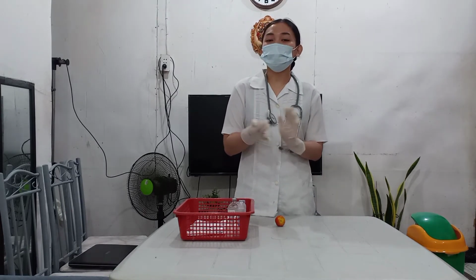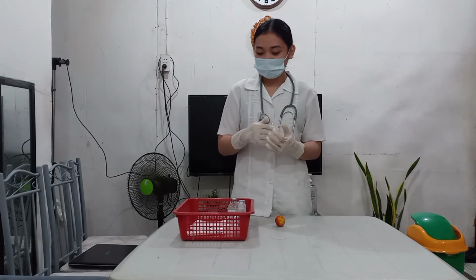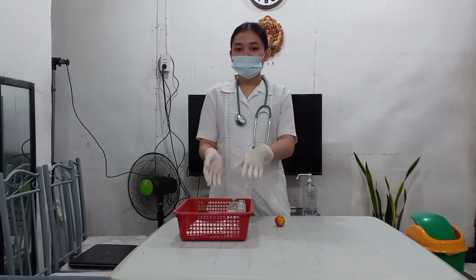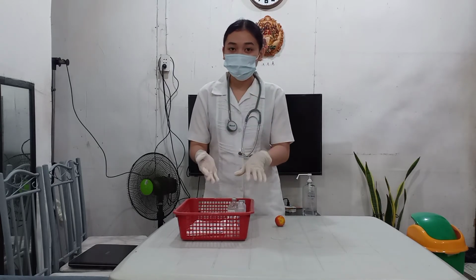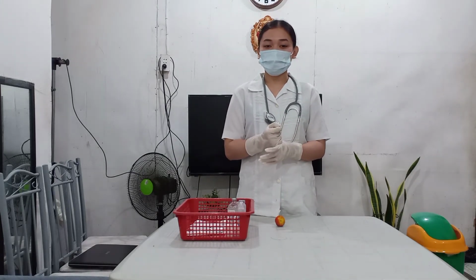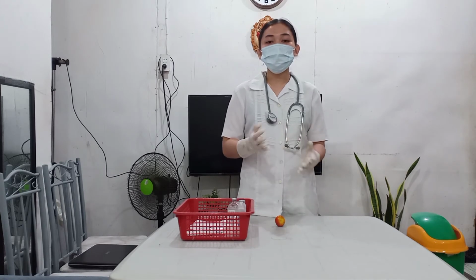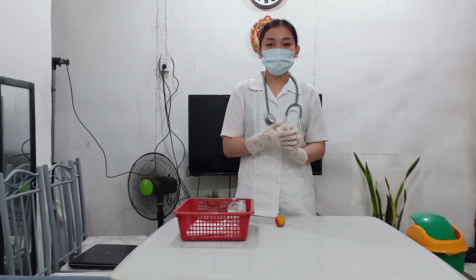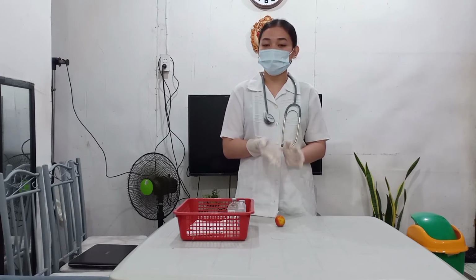So, since I've already prepared the medication from my previous procedure, which is the preparation of medication from vial and ampule, and it's already prepared here in my medication tray, I will now proceed to the third step, which is to introduce self and verify the client's identity. Introducing myself and verifying the client's identity fosters nurse-patient relationship while doing the procedures.